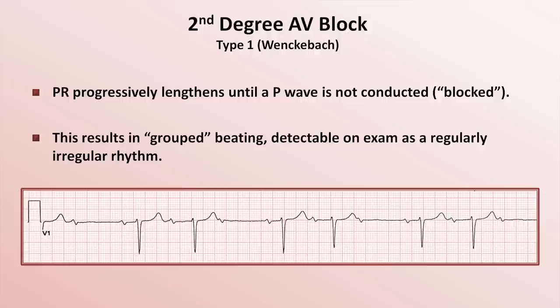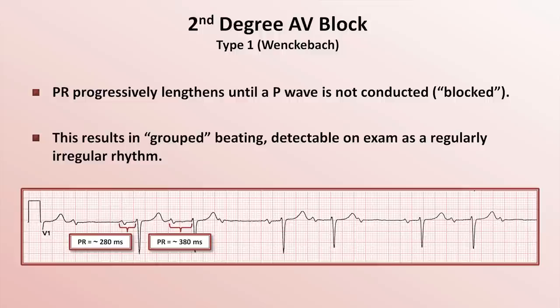Here's an example of type 1 block. The first thing you might notice is the repeating pattern of grouped beats. If you are feeling a patient's pulse or listening to the heart with a stethoscope, you would easily detect the patient's skipping beats. Next, look at the PR intervals. In the first complete cardiac cycle on the strip, the PR interval is about 280 milliseconds. For the next beat, it's about 380 milliseconds. And then we see a P wave that falls on the end of the T wave and is not subsequently followed by a QRS complex — this is a blocked P wave. In my experience, type 1 block is usually asymptomatic, but occasionally a patient may complain of palpitations or, very rarely, lightheadedness as a consequence of a resulting bradycardia.